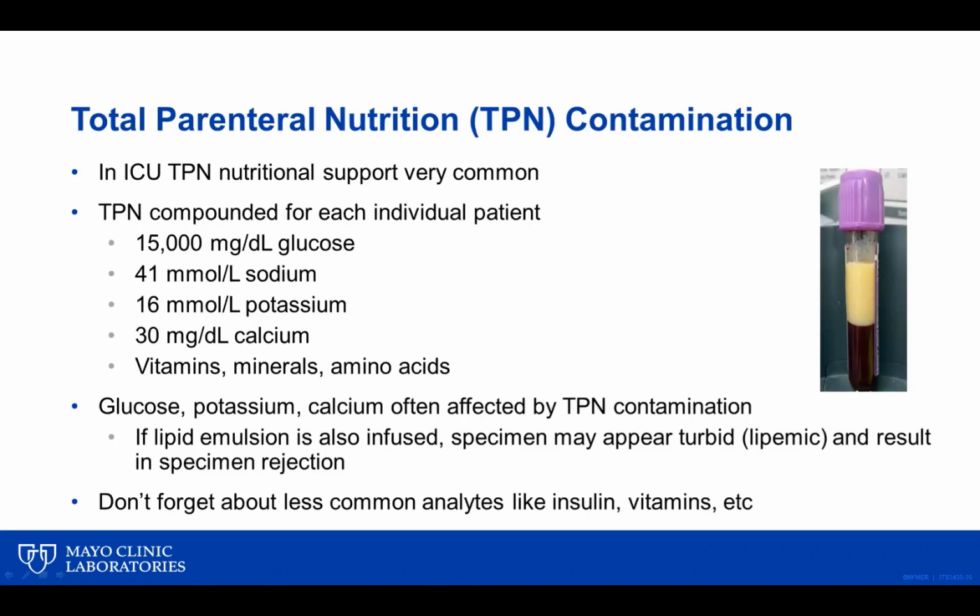But we need to remember that there are a lot of other things in TPN that can affect testing. So we need to think about other analytes that we often don't think about, such as insulin or vitamin measurements, because those too can be impacted.